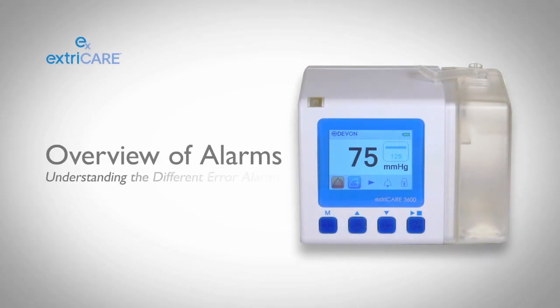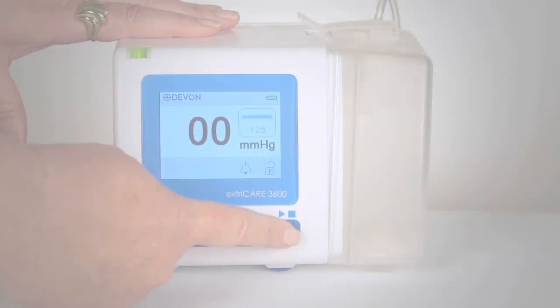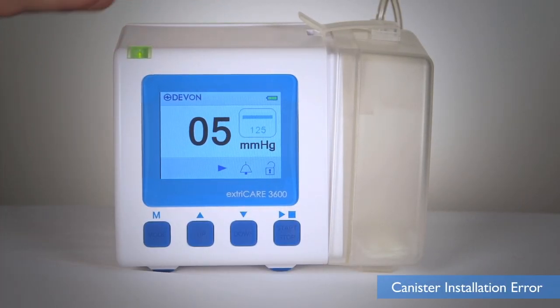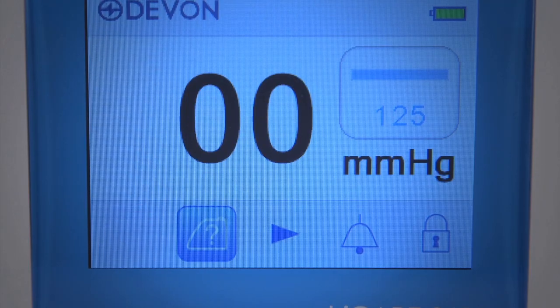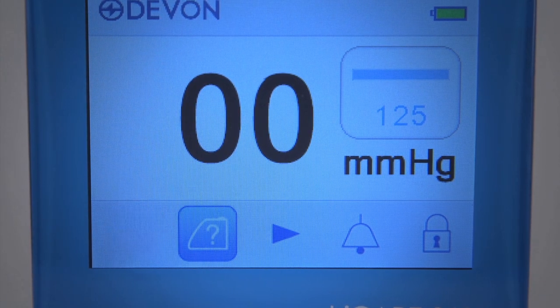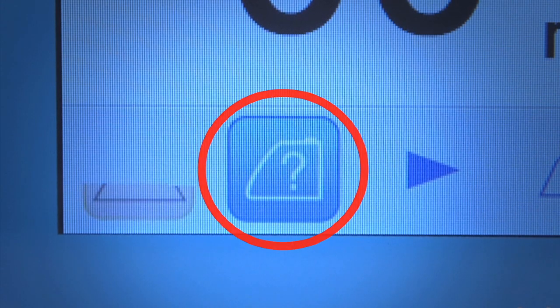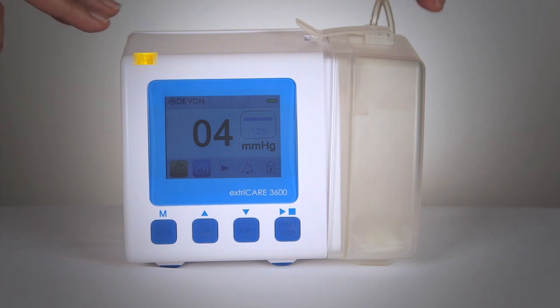Our ExtraCare 3600 pump comes with error alarms to ensure safe operation and use. The canister installation error alarm will sound when the canister is not detected or installed incorrectly. The device will not operate. The LED light will flash yellow and the canister error symbol will appear on screen until the canister is properly installed.